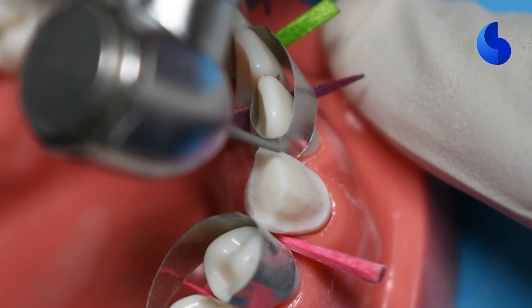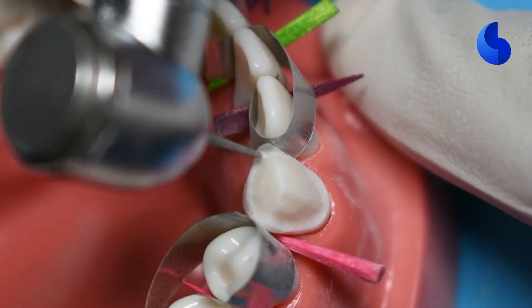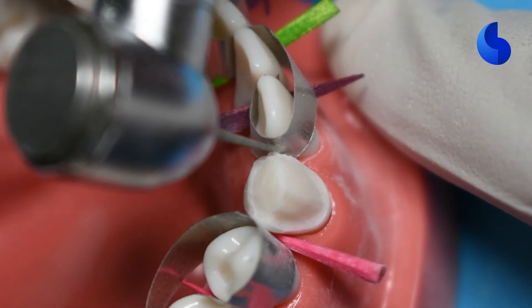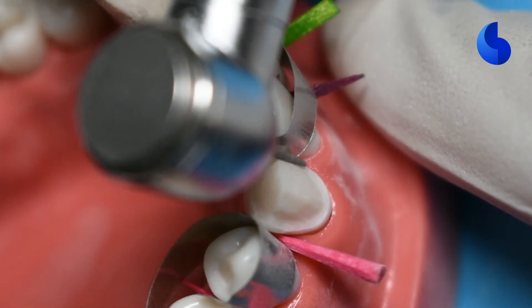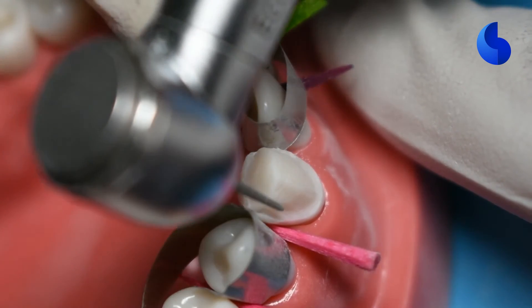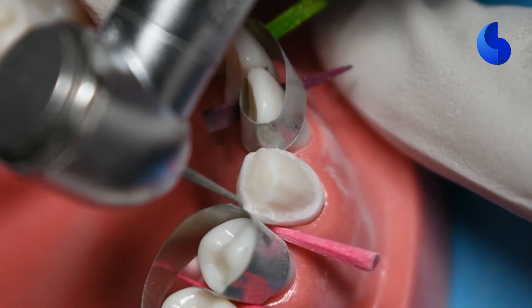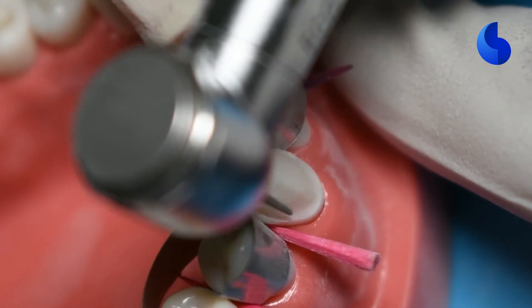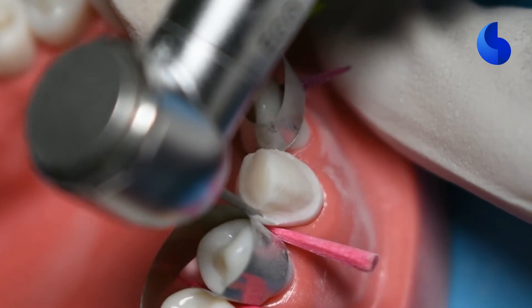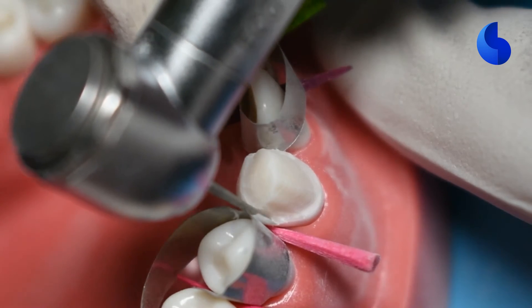Once you're done with your facial reduction and happy with the adequacy — we're looking for 1 millimeter — you can move on to your interproximal reduction to remove that island of tooth structure and break your contact. When doing this, make sure that you're protecting your adjacent tooth structure. You can leave a shell of enamel while doing it. You can also use a matrix band and wedges like we've used here, or fender wedges, which come with a matrix band attached — this helps to protect your adjacent tooth structure. Use a very thin diamond bur, something like 856-012 or a 169L carbide bur, which is very thin and helps you navigate through this area. Then bring in a larger bur like an 856-016 to establish the margin you're looking for, which is 1 millimeter in width.